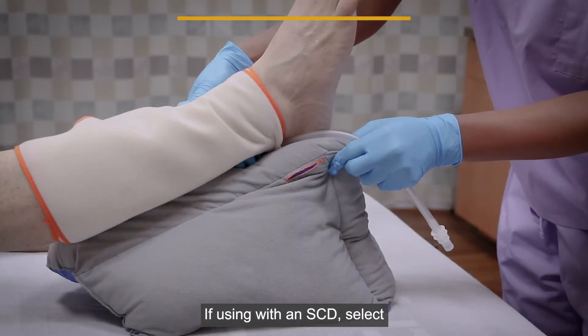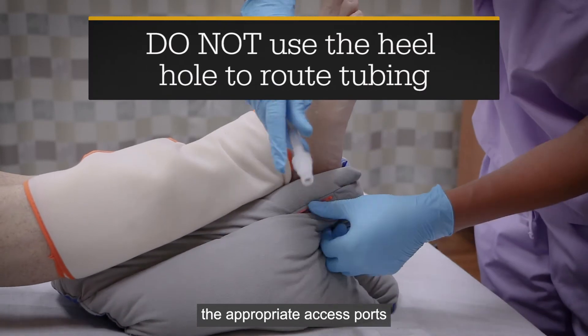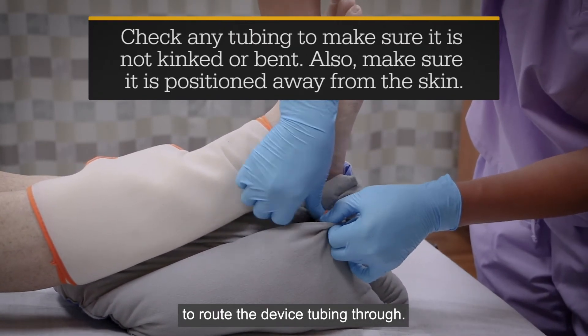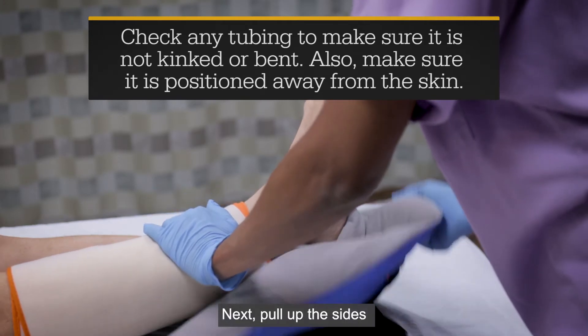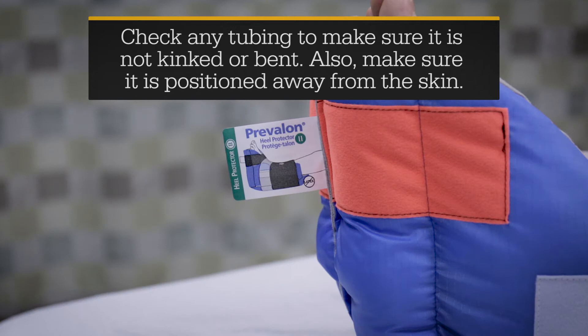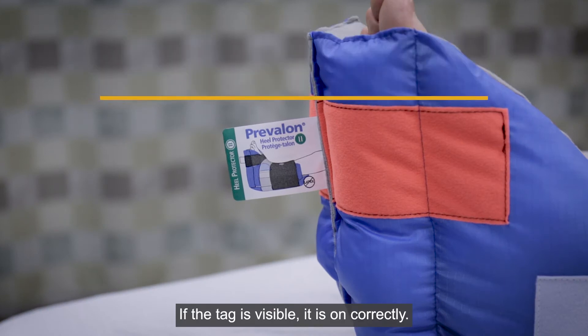If using with an SCD, select the appropriate access ports to route the device tubing through. Next, pull up the sides of the Heel Protector. If the tag is visible, it is on correctly.